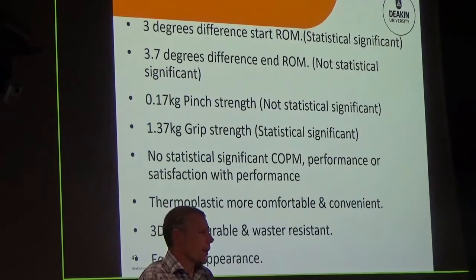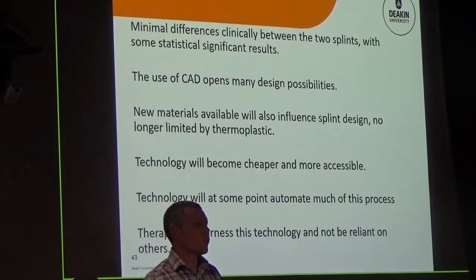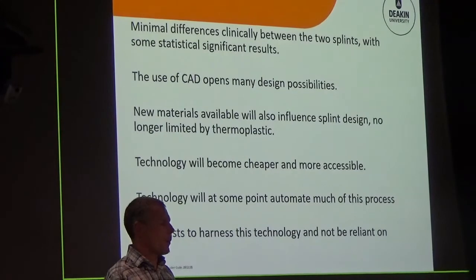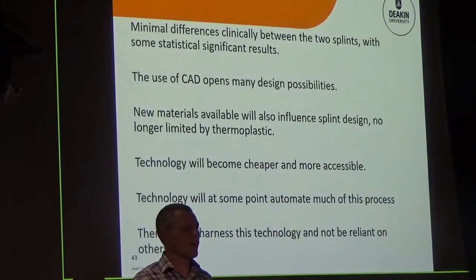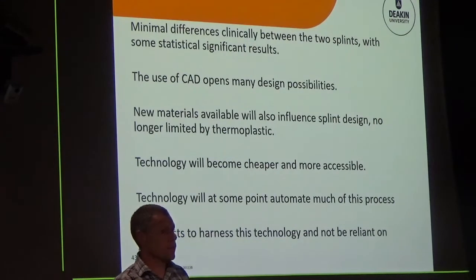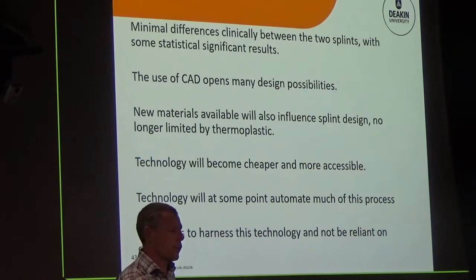So all this said and done, we got to a point that we said that there was minimal clinical differences between the two splints. So we get to a point that some people prefer the 3D one, some people preferred the thermoplastic one. The aspect to produce strength and pinch and range are all pretty much the same. So then you start to ask the question, which one is better for other reasons? The aspect, the skill of someone to mould that splint, for example. So if you take that factor away, is it better that it can be reproduced exactly the same every single time?